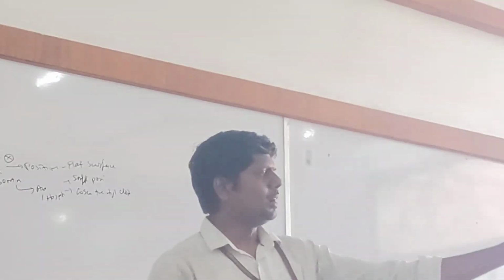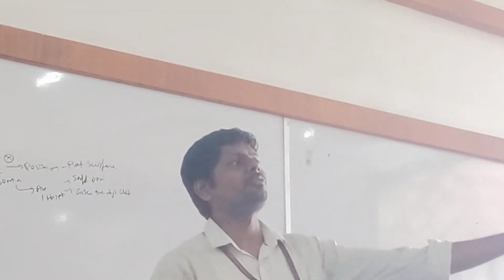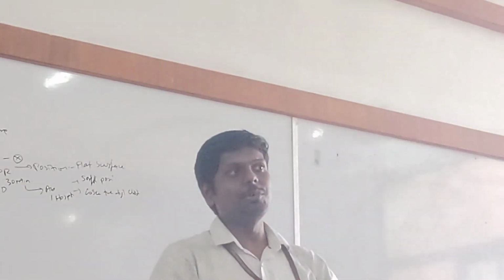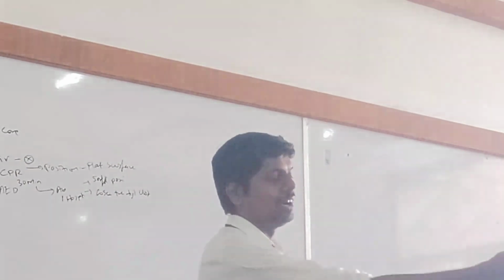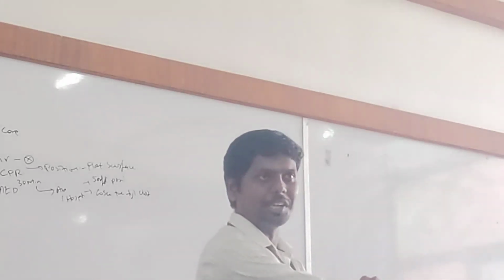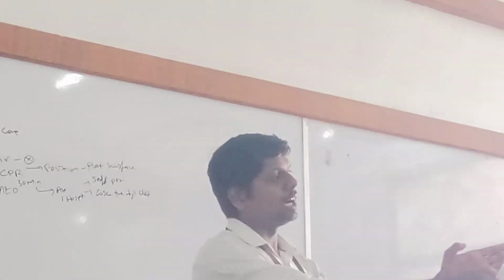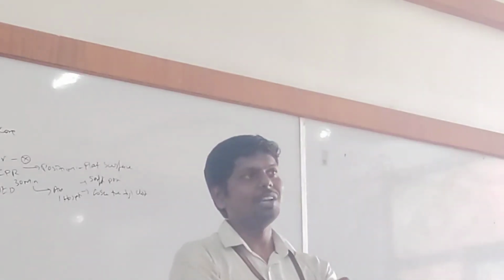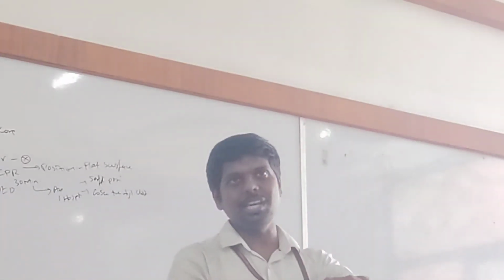Yesterday what happened? Abhishek was taking blood from Muskan, and Muskan's positioning was not right. Abhishek didn't know her hand was on this side and couldn't penetrate properly. So I made Muskan turn that side, and Abhishek got the proper position. Abhishek made a second mistake.